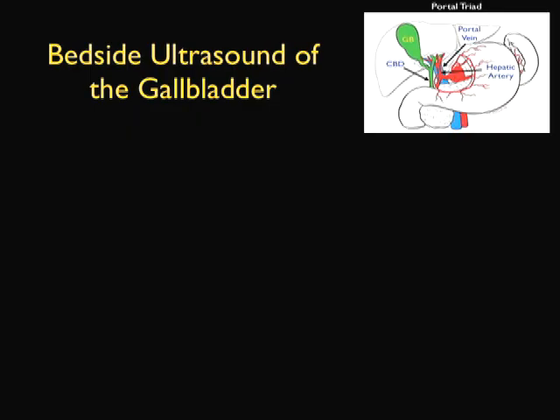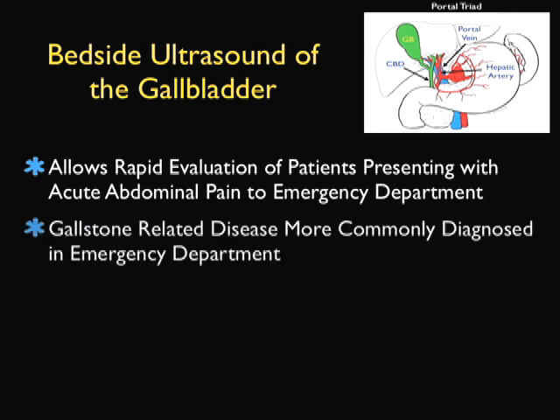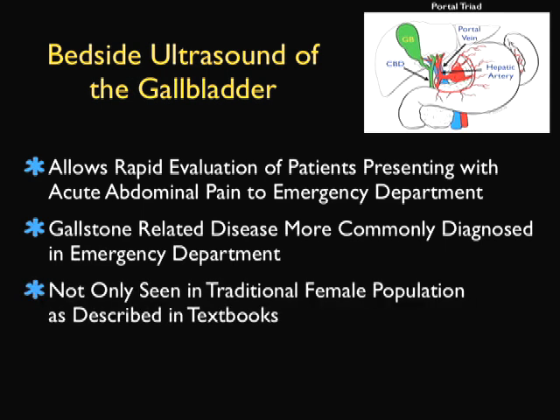Welcome to Soundbites Ultrasound, focusing on the imaging of the hepatobiliary tract. Bedside ultrasound of the gallbladder allows rapid evaluation of patients presenting with acute abdominal pain to the emergency department, and gallstone-related disease is now more commonly diagnosed in the ED, secondary to the increased use of ultrasound scanning at the bedside. Interestingly enough, gallstone-related disease is not only seen in the traditional female population as described in textbooks.